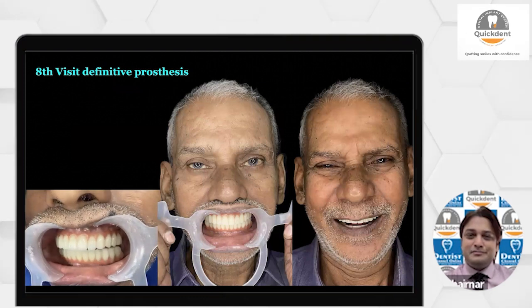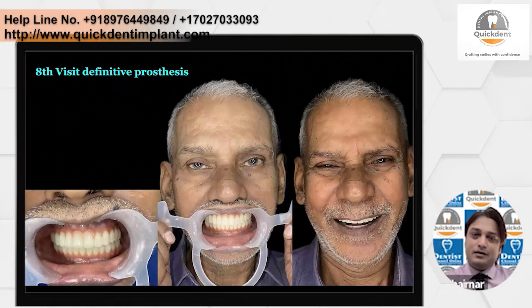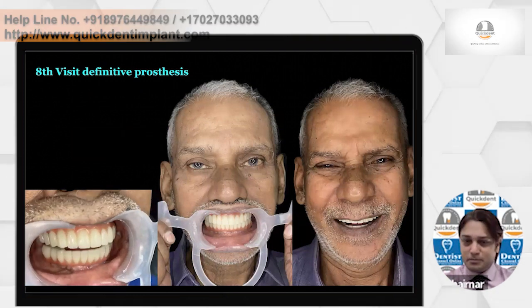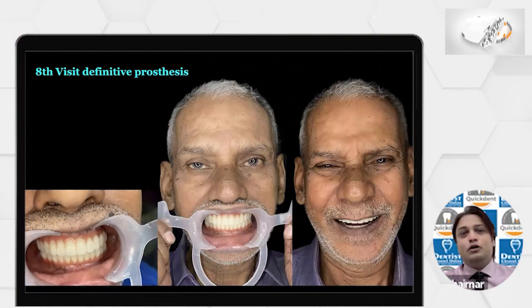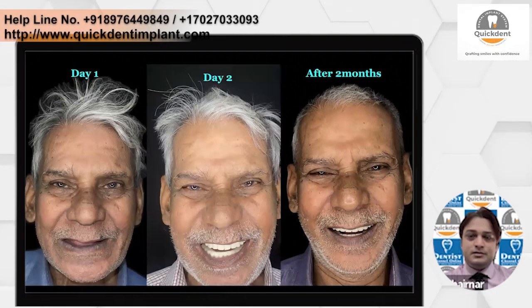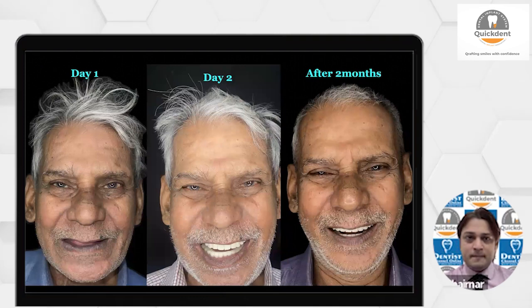So the patient is basically getting his teeth on day 2 of the surgery, and I think after 2 months, in another 2 visits, he's getting the final process. But then you have to do a lot of homework for such cases. Okay, so that's day 1, day 2, and after 2 months of the patient.